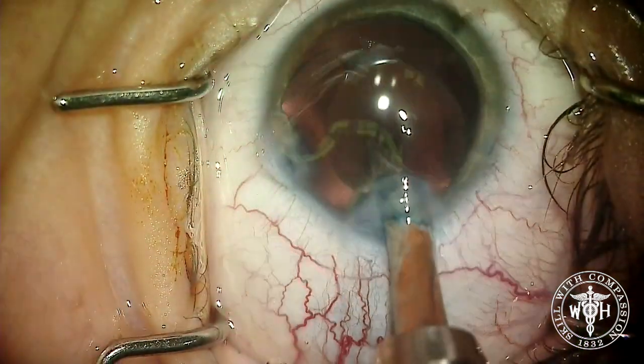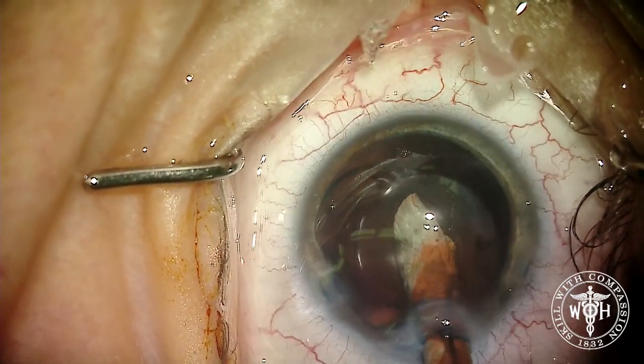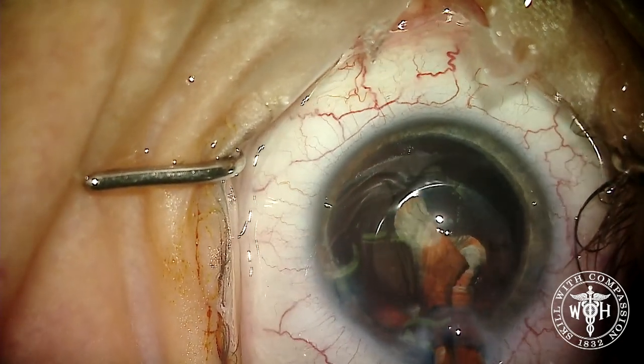We put this in the Silver Series inserter made by AMO. This inserter is not made for this device, but it happens to work pretty well. An important step is right here: making sure that the leading edge of the artificial iris goes into the capsular bag.